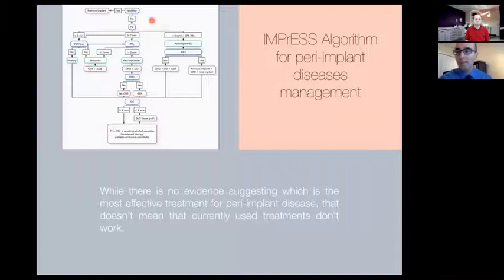In terms of surgical management, some people may say we do flap surgery and then bone grafting, but we cannot do bone grafting in all cases of peri-implantitis. We have to look at the radiographic or clinical bone topography. If you have a well-shaped, funnel-shaped defect around your implants, the apical portion of this defect might be amenable to regenerative therapy. But the coronal portion may not be, because you will not be able to regenerate bone in 360 degrees. It's very unpredictable. So you may end up doing some implantoplasty.